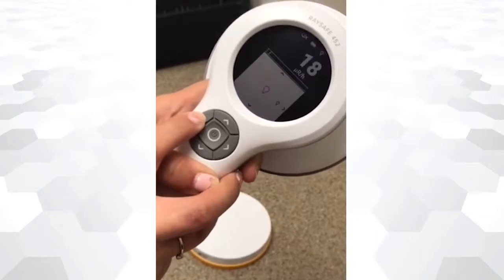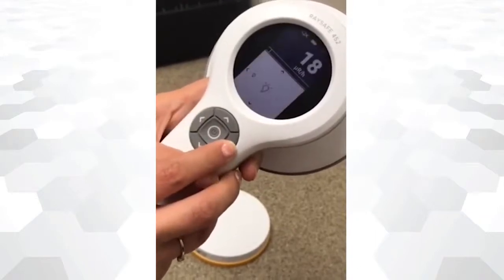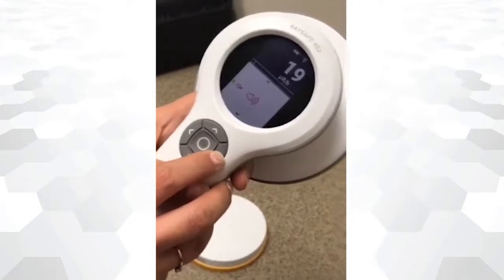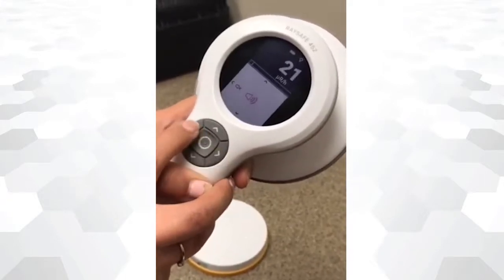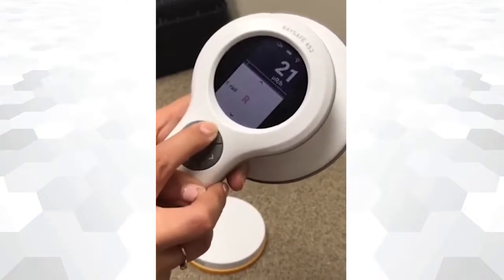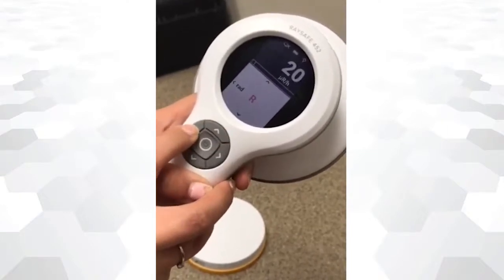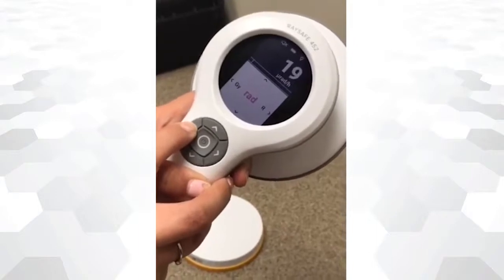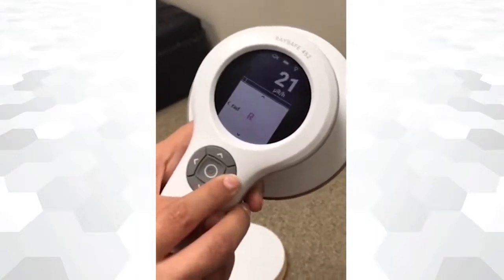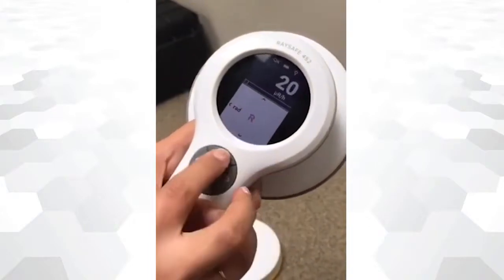To change the screen light settings, press the upper arrow button and select the brightness desired. Press the upper arrow again to change the auto settings. Units are changed by pressing once again the upper arrow — select the unit that better suits your radiation measurement.